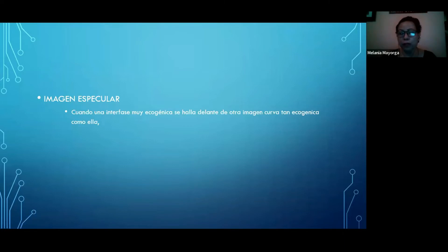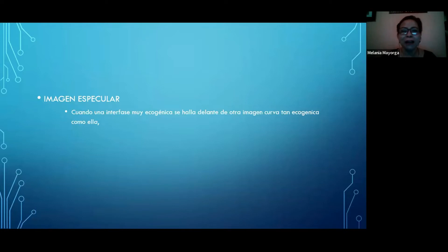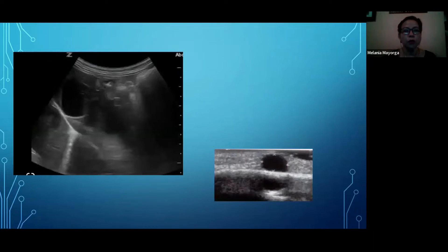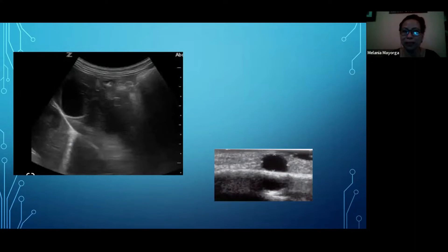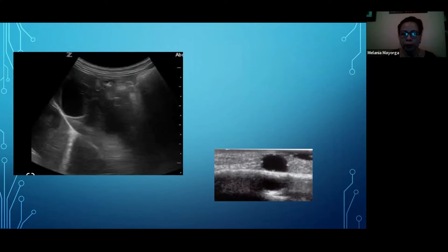La imagen especular: tenemos que tener mucho cuidado, porque es cuando una interfase muy ecogénica se halla delante de otra imagen curva tan ecogénica como ella. Podemos equivocarnos y creer que estamos viendo dos lesiones similares. Las imágenes especulares nos van a decir qué tipo de contenido tiene nuestra lesión. Muchas veces hay vejigas tan llenas que nos pueden dar una imagen especular y podemos llegar a creer que hay líquido libre intraabdominal. Siempre hay que tener mucho cuidado, aunque son un artefacto, siempre nos van a servir de ayuda diagnóstica.